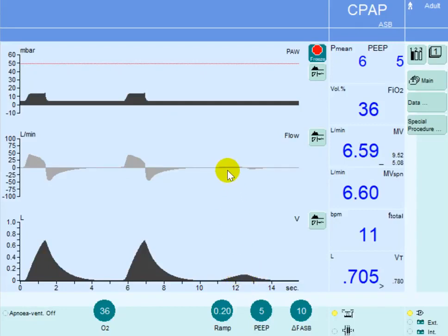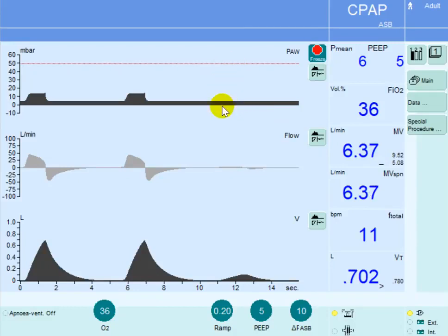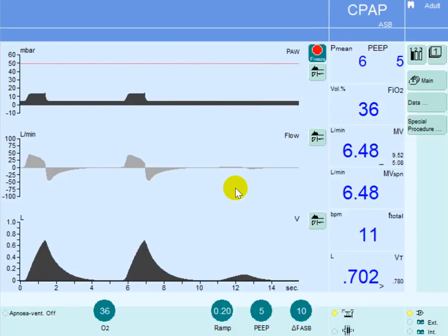However, that inspiratory flow was less than 5.7 liters so he could not trigger the ventilator and that's why you don't see any pressure support given with this inspiratory effort. This is what we call wasted effort.